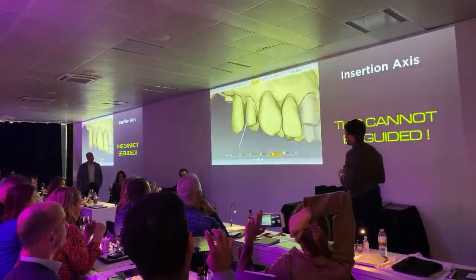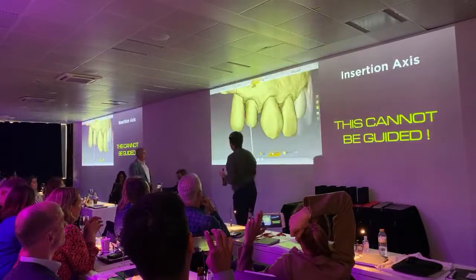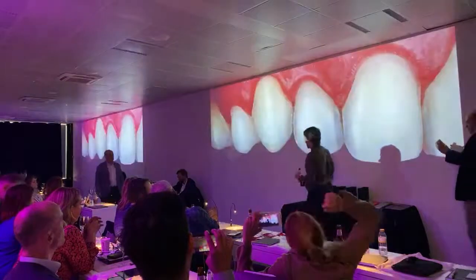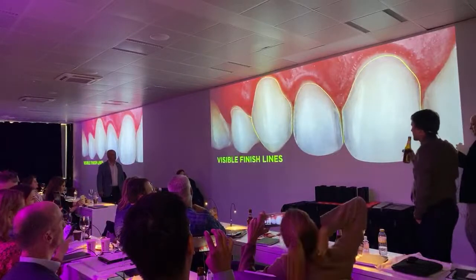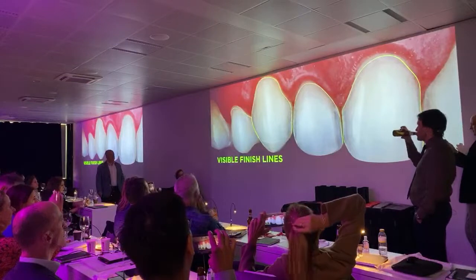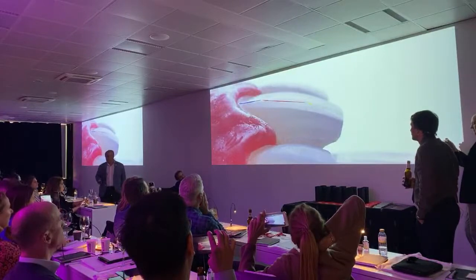You can activate it and you can see occlusal clearance and interproximal clearance. Buccal clearance only with the quality control. Visible margins. This is a top prep for CAD-CAM. A small chamfer. It's perfect for us.